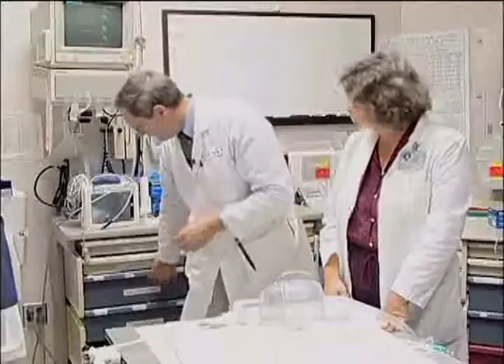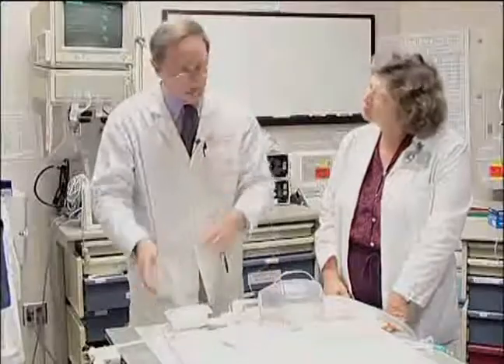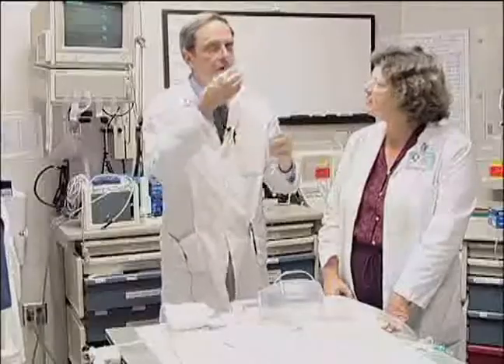The patient who comes in who has massive maxillofacial trauma, we just have to try and stop the bleeding so that we can see to intubate those patients. And oftentimes they'll have buccal mucosal lacerations, they'll have jaw fractures. And an easy way to try and take care of that problem is just to make some very quick dental rolls with the patient. And if this cheek is all lacerated, you can simply go ahead and roll these up and just stick them in there.